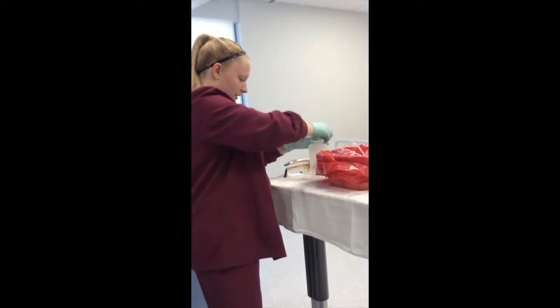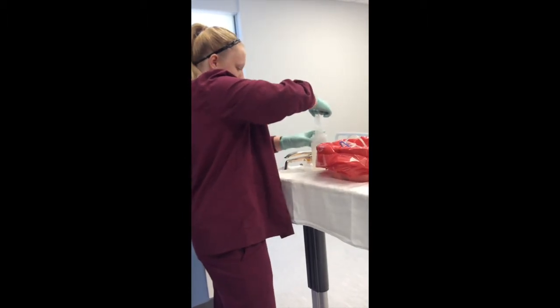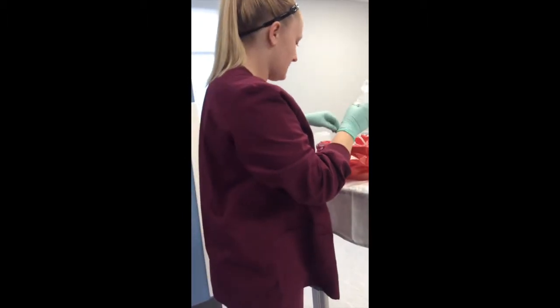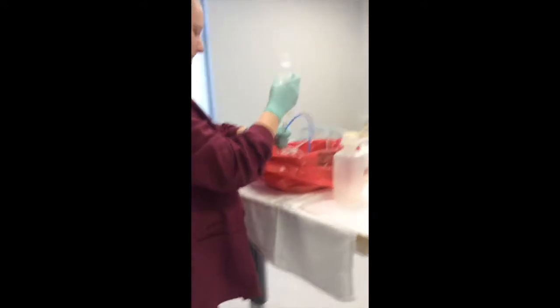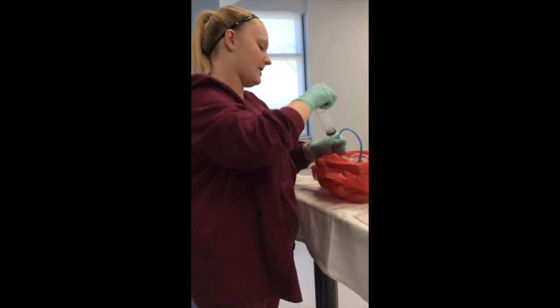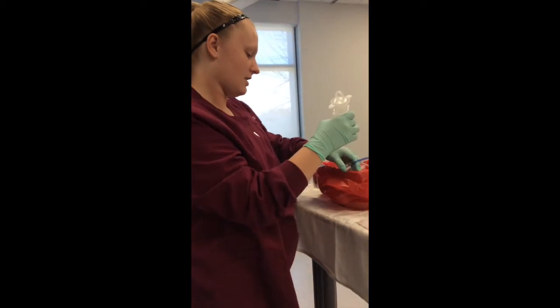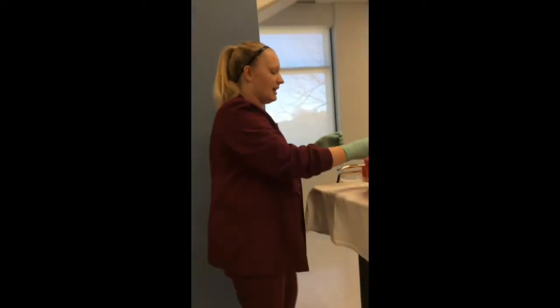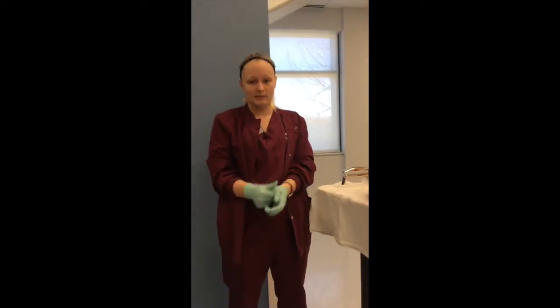And I'm going to take 30 more milliliters to irrigate it with. I'm going to irrigate it with 30 more milliliters there at the end. And I'm going to go ahead and clamp it back and undo my syringe. And then at this point, I'm going to go ahead and take my gloves off and document my administration.